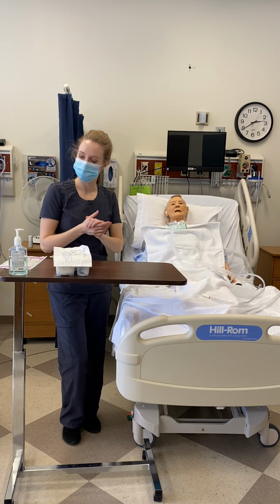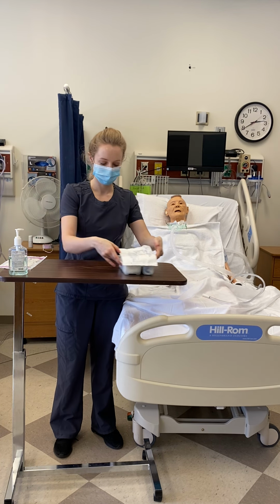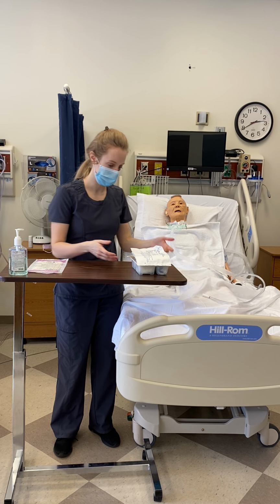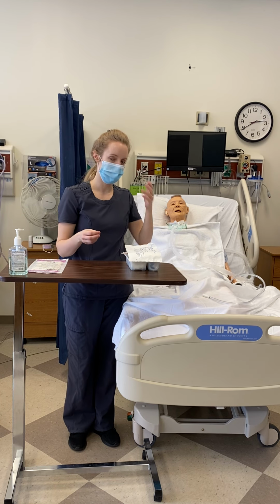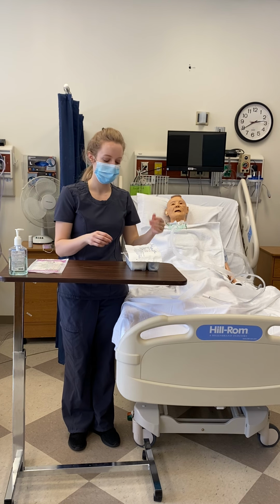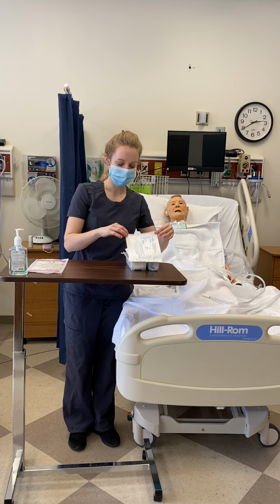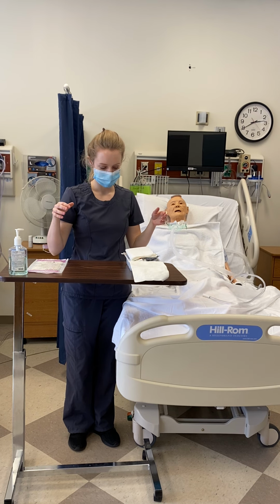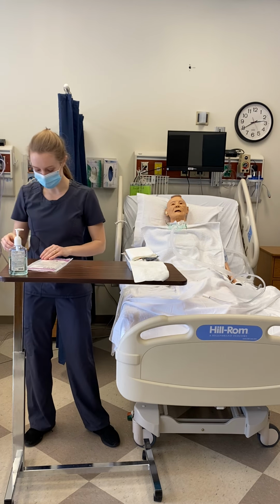Once I have done all of this, I now perform hand hygiene and make sure I have my equipment at the bedside that is appropriate. We may also be wearing eye protection here. So I'm opening my tracheostomy care kit, and then I'm donning my sterile gloves.